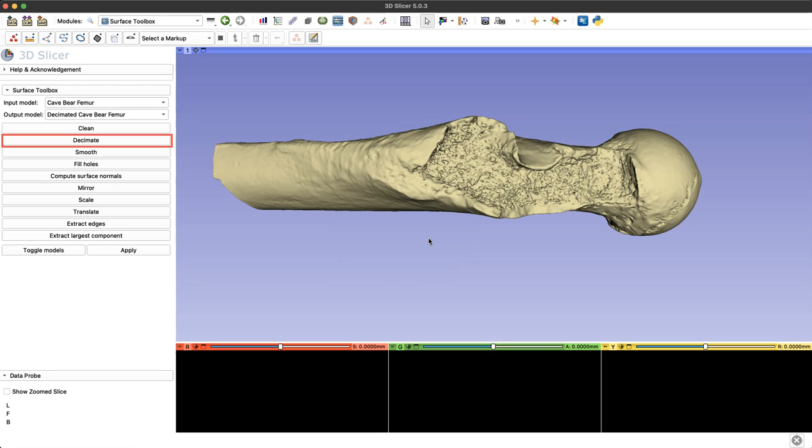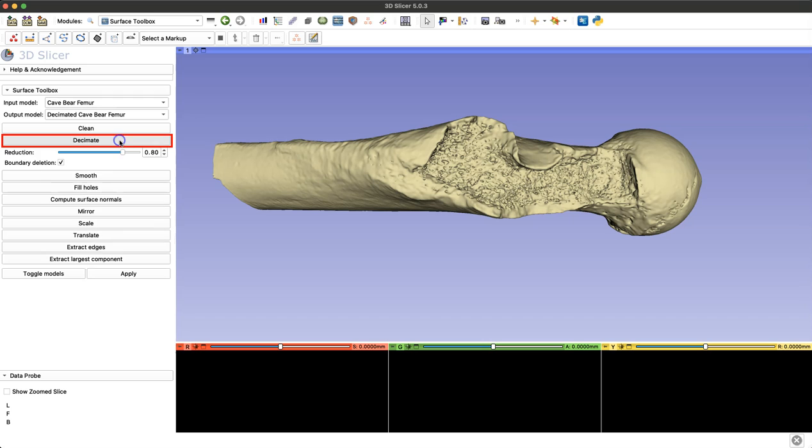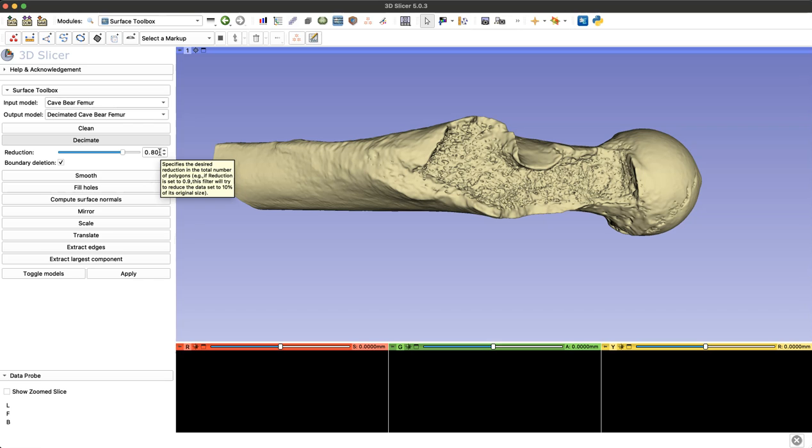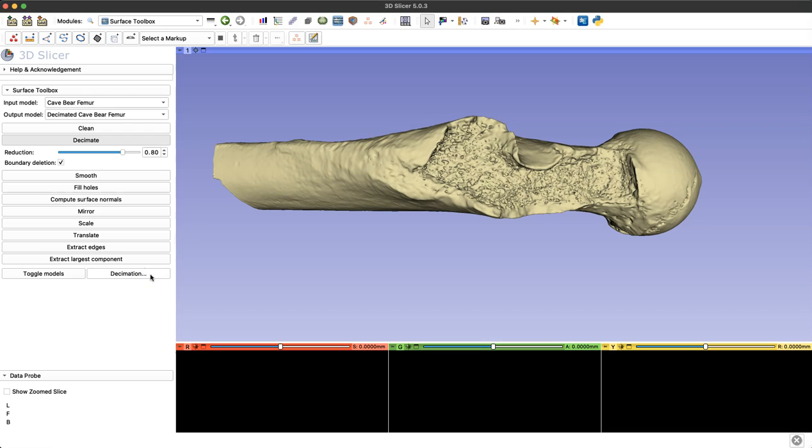Now I simply click decimate and I just have to choose how much I want to reduce my model by. So I'm going to leave this at 0.80 for today, but you just have to experiment with your model to find the right amount of reduction so that you're not losing quality but you get the file size that you need. And simply click apply.